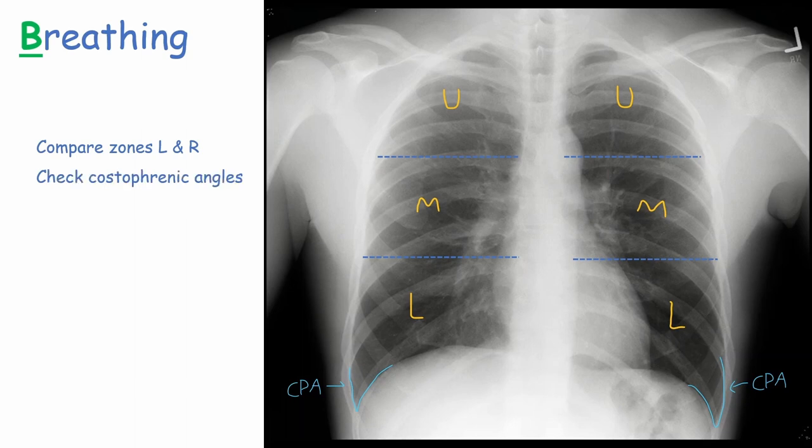We then need to check that the costophrenic angles are clear. Blunting of the costophrenic angles could represent a pleural effusion or consolidation. Next, check the surrounding pleura for any thickening, which could be a result of asbestos exposure or cancer.